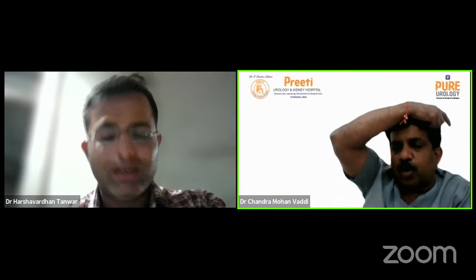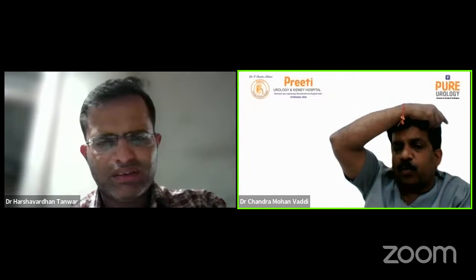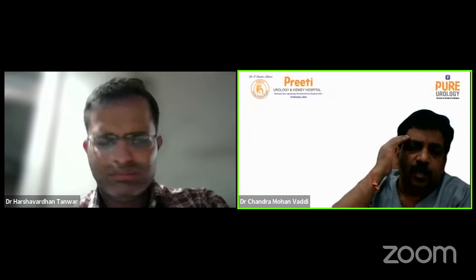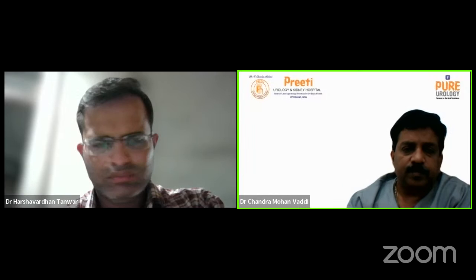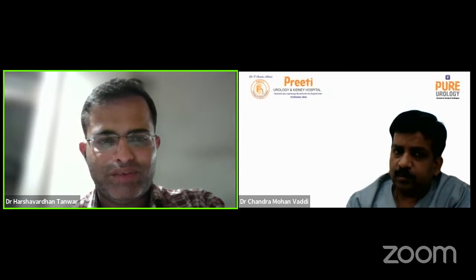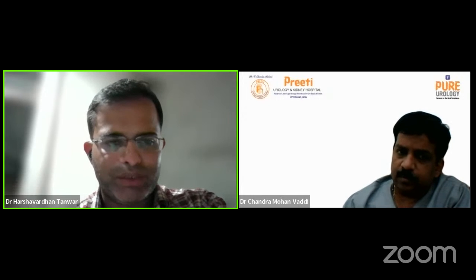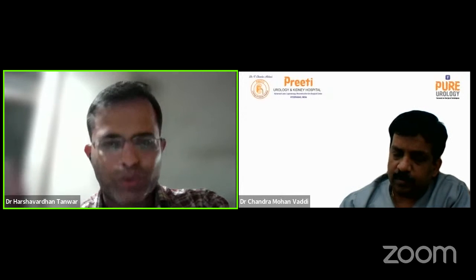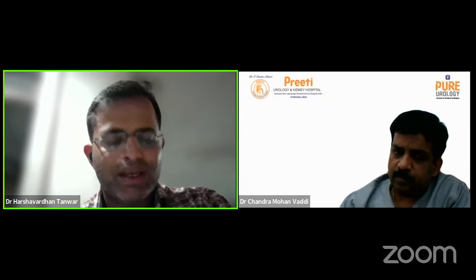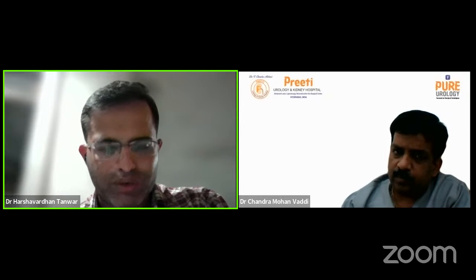Yes. Forget about monoplanar. Entry point, it's only your intuition, like you said, you think with your brain and go ahead. Yes, sir. We need to think with the brain and go ahead, because God has created a different human being. No two kidneys are similar, like no two faces are similar in the world. Everything has to be on table itself.